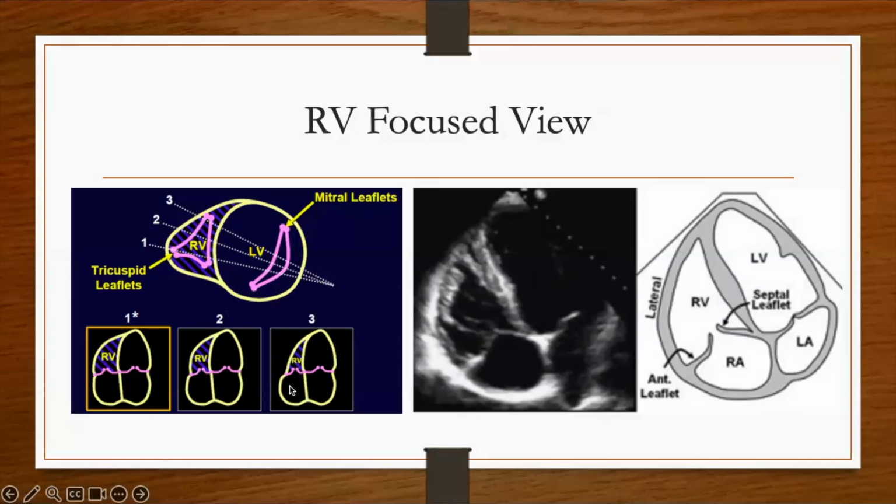So it's not just zooming on the right ventricle, but angulating in a way that you can see the lateral wall of the RV, and the RV apex is pointing more laterally. There is a definition: try to keep the apex in the image, however try to show the maximum of the RV. Do not lose the LV, so find the apex and show the maximum diameter of the RV.